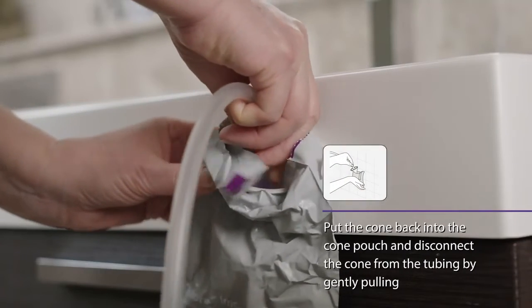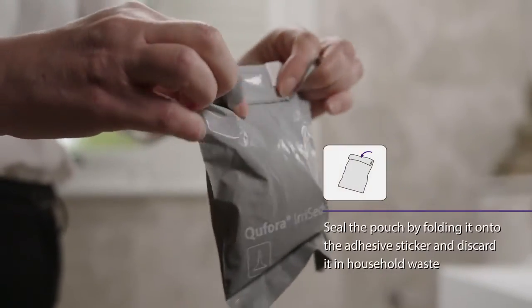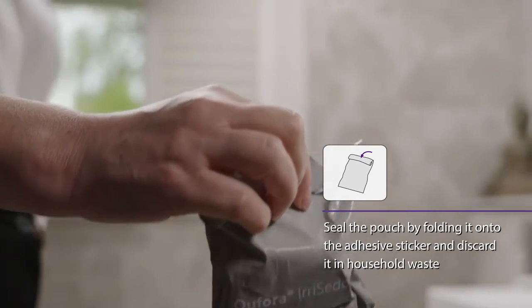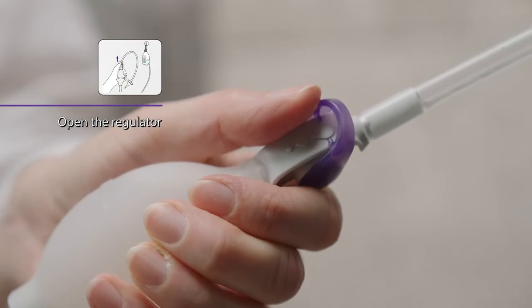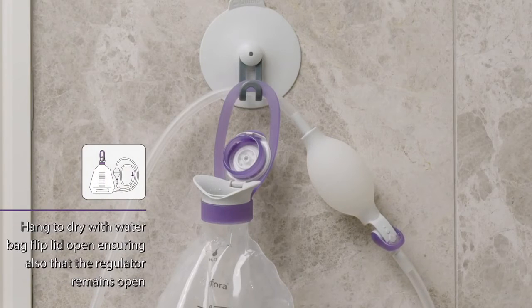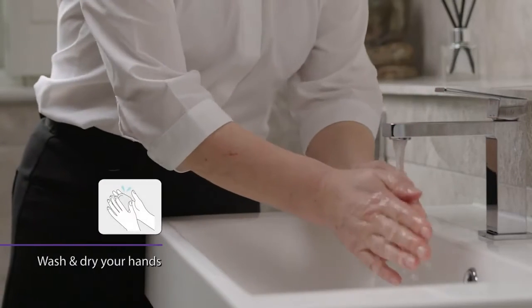Put the cone back into the cone pouch and disconnect the cone from the tubing by gently pulling. Seal the pouch by folding it onto the adhesive sticker and discard it in the household waste. To empty water from the system, open the regulator. Hang to dry with the water bag flip lid open, ensuring also that the regulator remains open. Wash and dry your hands.